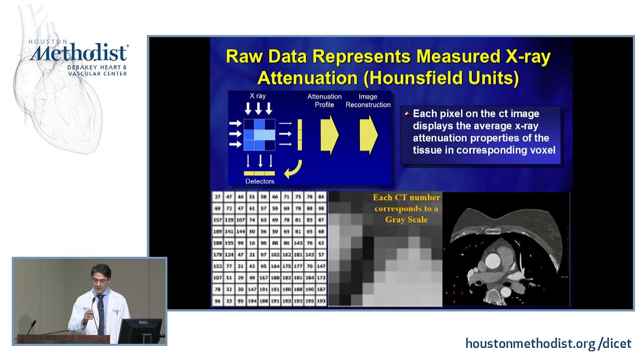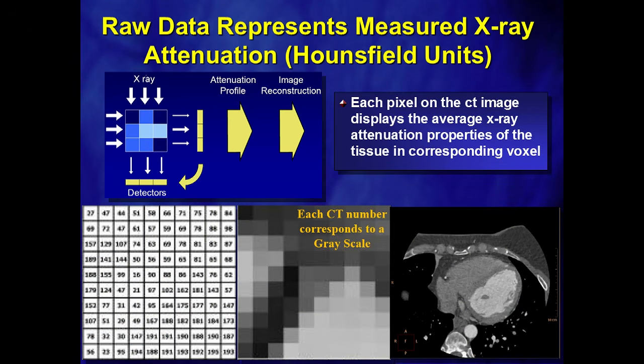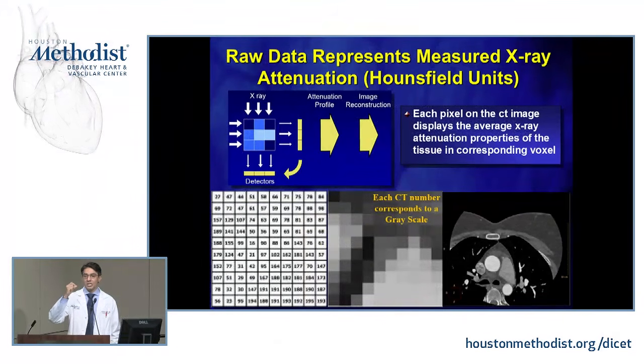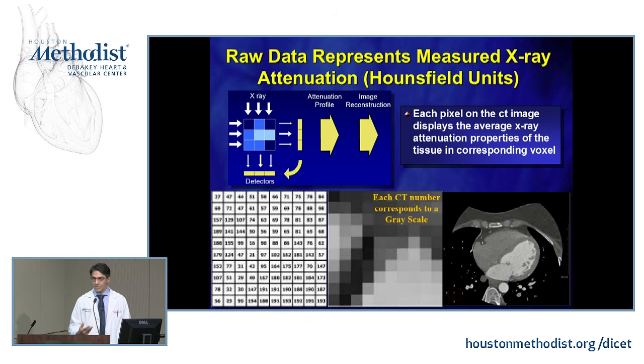So how do you actually create these images? Imagine the patient is in the scanner, and you've created numerous projections around them with numerous X-ray beams. For each pixel, you've collected a Hounsfield unit, or linear attenuation coefficient, depending on how much attenuation that pixel saw. With CT, most of it is grayscale, so if you put all these grayscales together, you can start forming an image of the original structure.